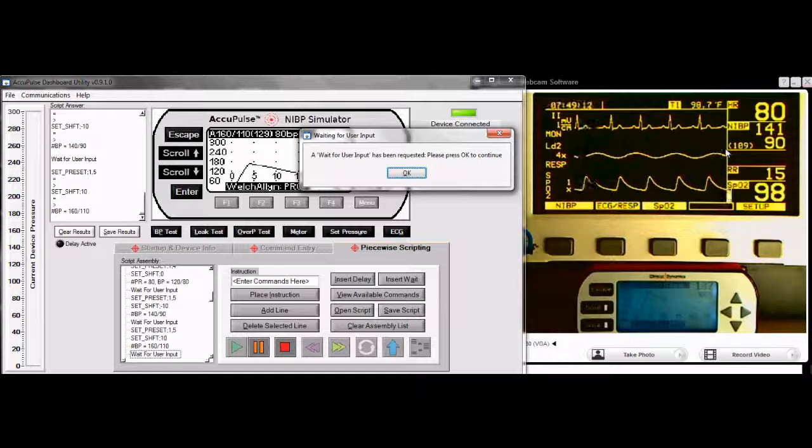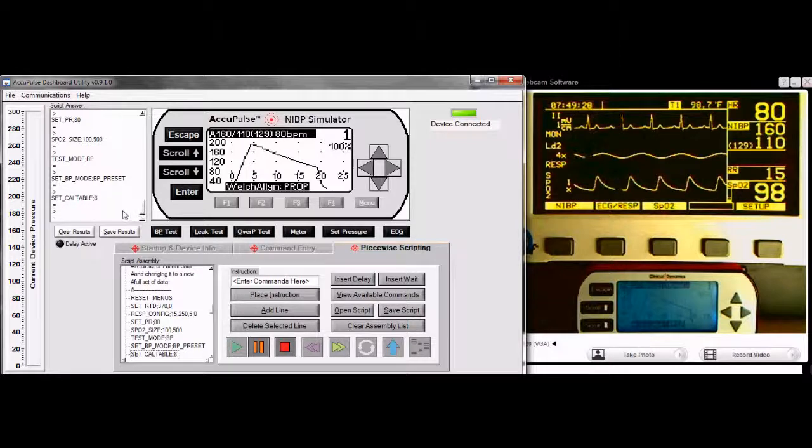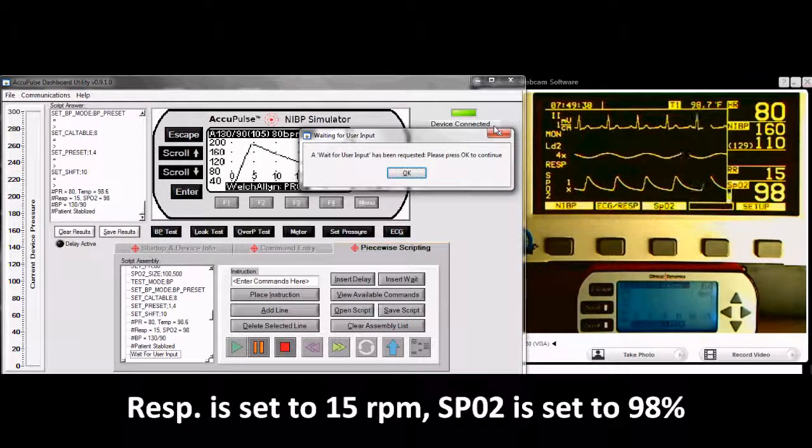As a hypothetical example, a subject who is either wounded or critically ill may be evaluated in the field and require transportation to a hospital facility. Over time, the heart rate climbs from 80 to 110 beats per minute, producing sinus tachycardia.